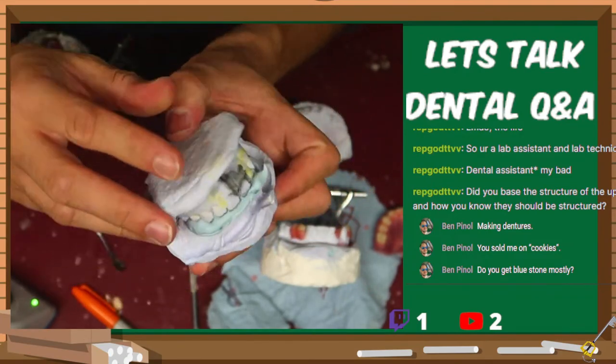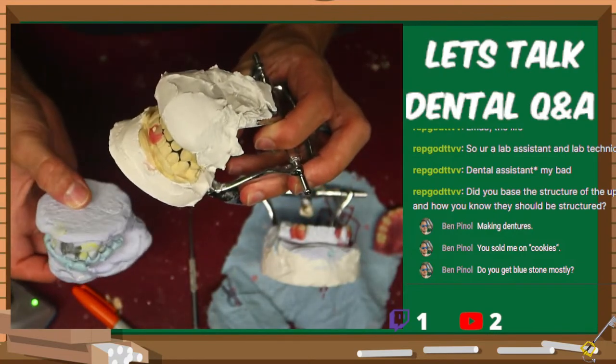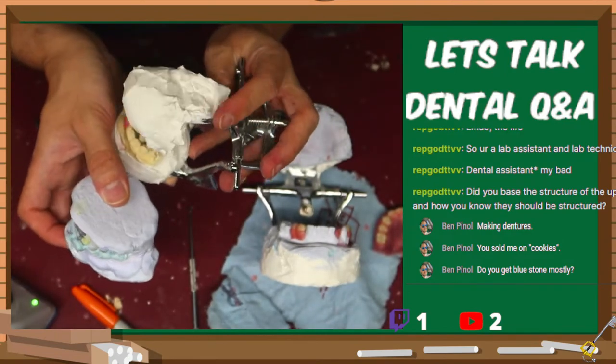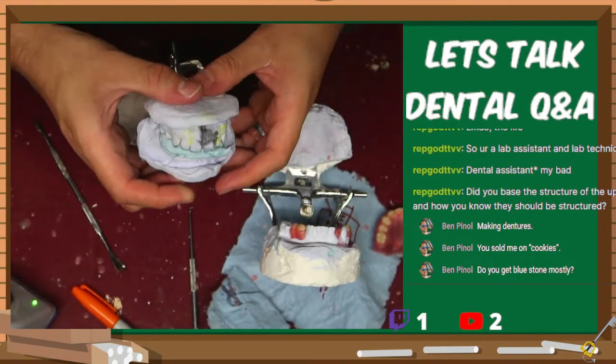This person bites in a class 1 occlusion, and I can set it onto one of these articulators, pour it up and everything. Every time I close, it will always return to that same similar bite. And so that's how we would go about figuring out their bite.